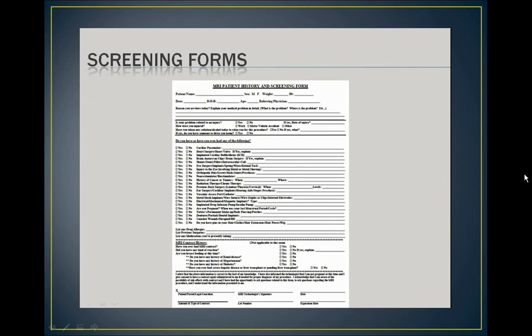Have you ever had brain surgery? Have you ever had aneurysm clips? Do you have any orthopedic implants? Have you ever swallowed a camera pill for a GI ulcer exam? Do you wear dentures, hearing aids, or have an ear implant? Do you have any mesh implants, wire sutures, staples, clips, or electrodes? Have you ever had a vascular access port or catheter placed?